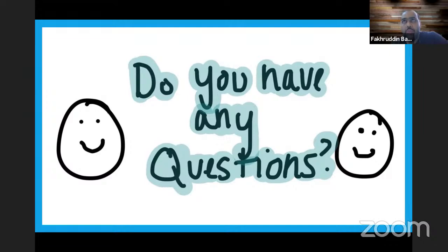If you want to go by empirical fitting, so if you don't have a trial lens with you, the standard curvatures are there. You have 8.5, 8.6, 8.4. Again, don't quote me. I don't recommend you doing this without keratometry because we need to understand the corneal curvatures before even you put the lens in. So if you can put in a standard curvature, probably an 8.4 and an 8.6, judge the fitting assessment and then go about finalizing. That could be one of the options, but again, it's not recommended. So having a keratometry reading is definitely an important thing.